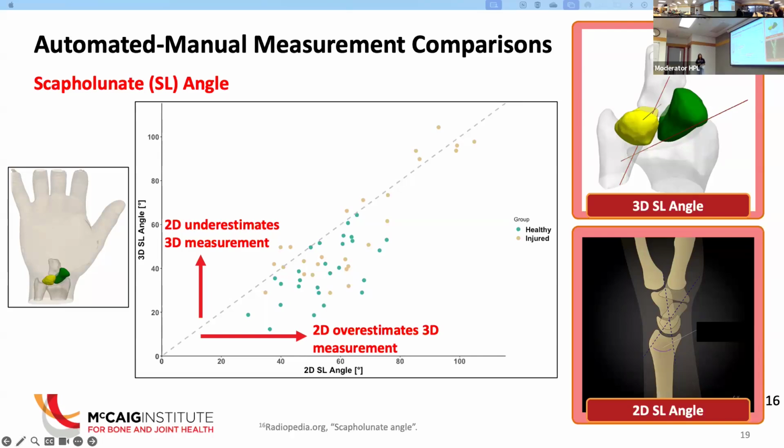It definitely took time to find a consistent technique that would identify the same anatomic landmarks across all those individuals. But now that I've gone through that work, it's not going to be as tricky. I think for sure this would work most effectively on injured individuals before you see osteophyte generation in those post-arthritis patients. That would require some adjustments, but for now it's a reproducible technique, so not a lot of problems with that.